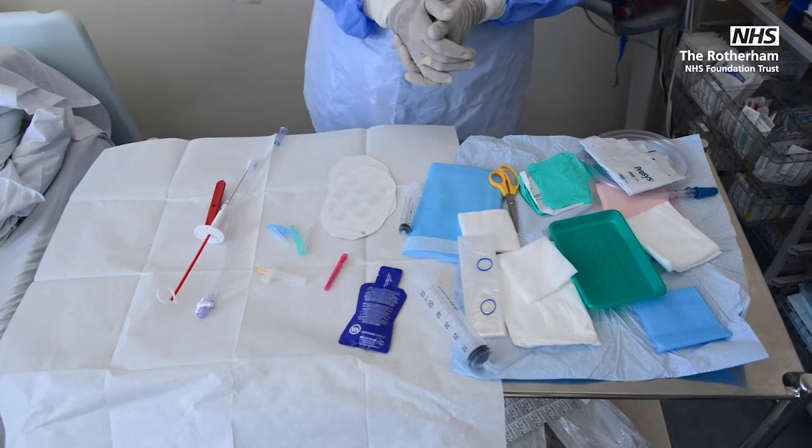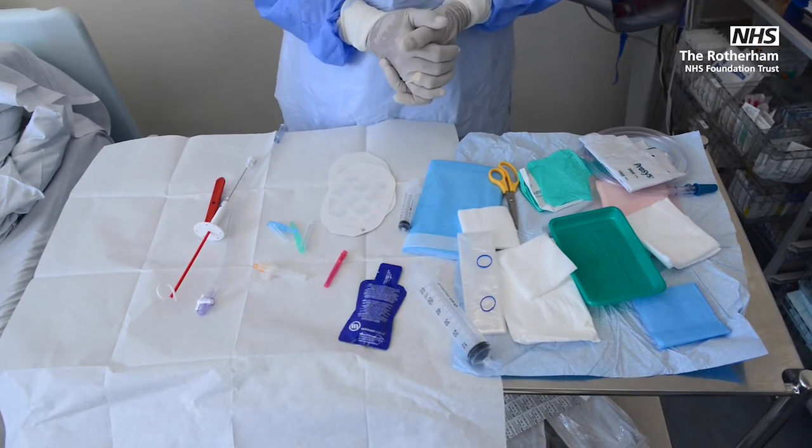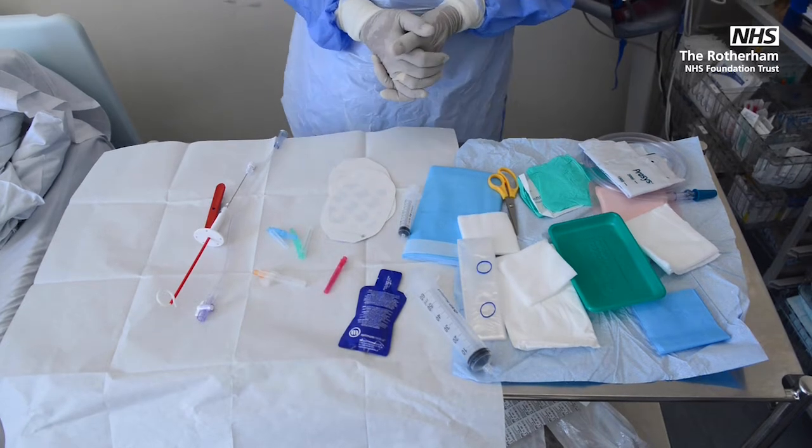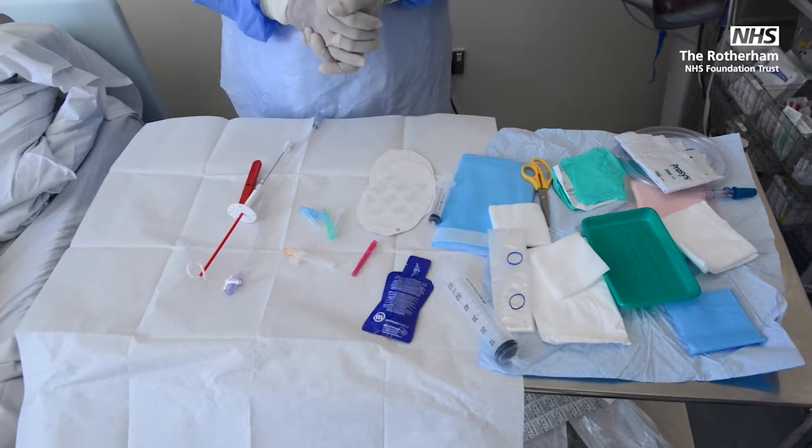So before proceeding with the procedure, make sure you have taken the consent from the patient. It's consent form 1 if they're able to consent for the procedure. So first we have to scan the patient and find the appropriate place where we are going to insert the drain. Then we need the dressing trolley and the sharps bin. Make sure it is near to your dressing trolley.